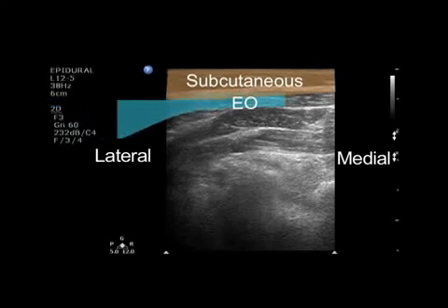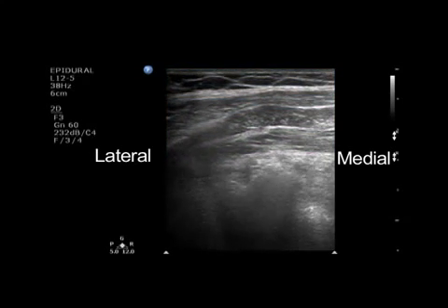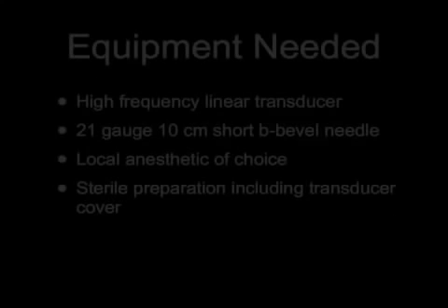The first brown layer is the subcutaneous tissue, the turquoise layer is the external oblique, the purple layer is the internal oblique, the transversalis abdominis appears green. One can also appreciate the movement of the bowel deeper in the image.